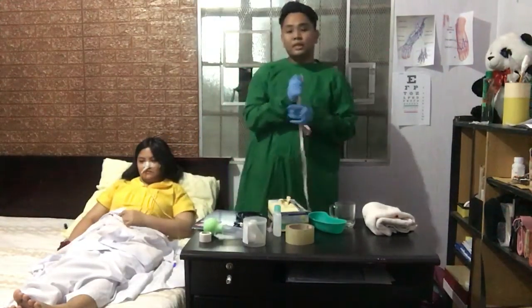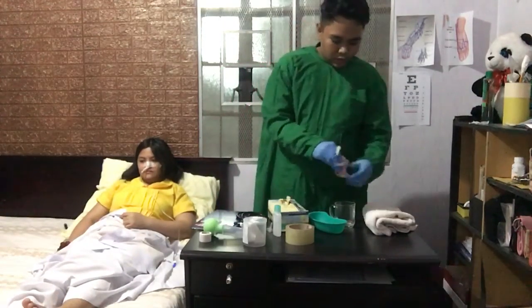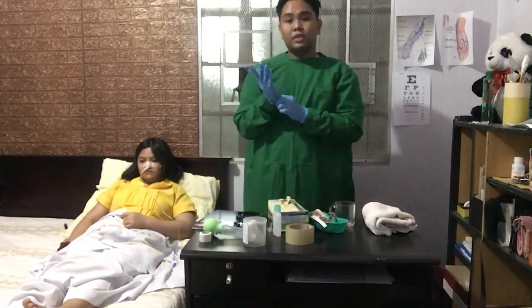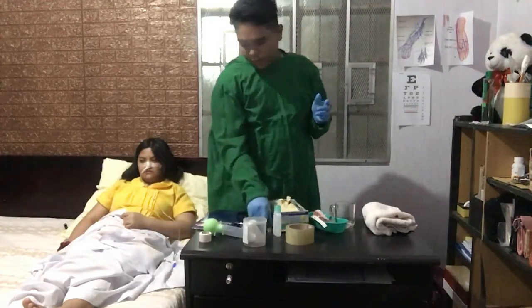Then, compare po natin siya sa NG tube na naka-insert po sa nose ng ating patient. Then, after po nun, so mag-attach po tayo ng syringe to the end of the tube and aspirate a small amount of stomach contents.